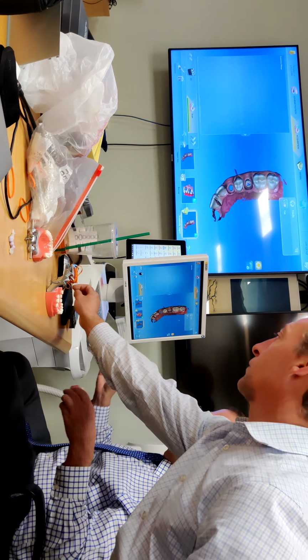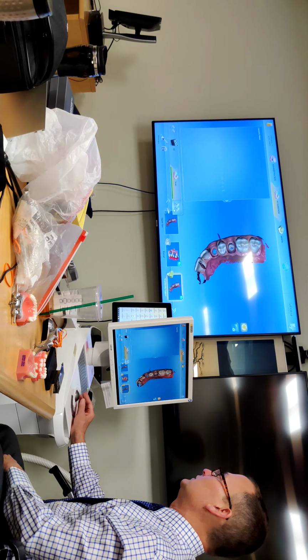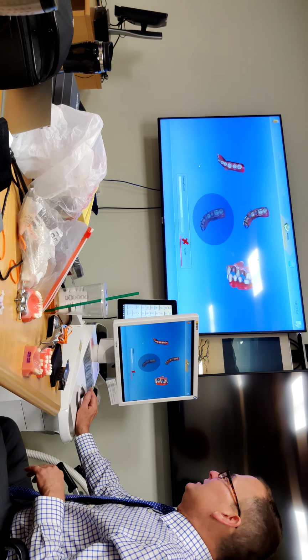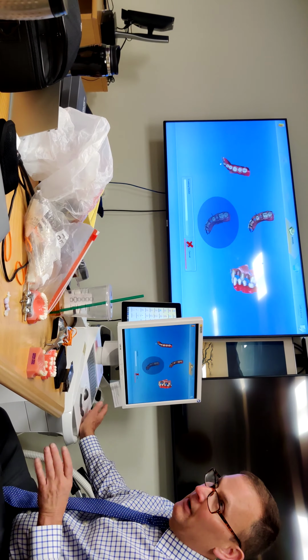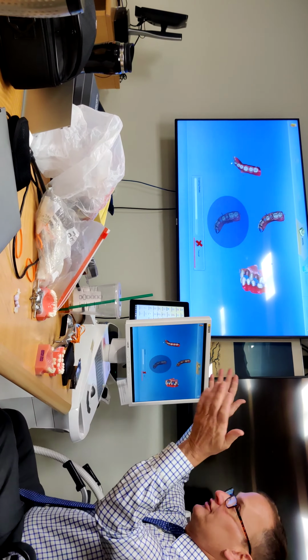Okay, and now see the double chevron. See the double chevron here? We can go forward. Sure. Now, it's going to make the models. With the prime scan, this is faster. Model making. With the prime scan, it's making the models while you're sitting there scanning.